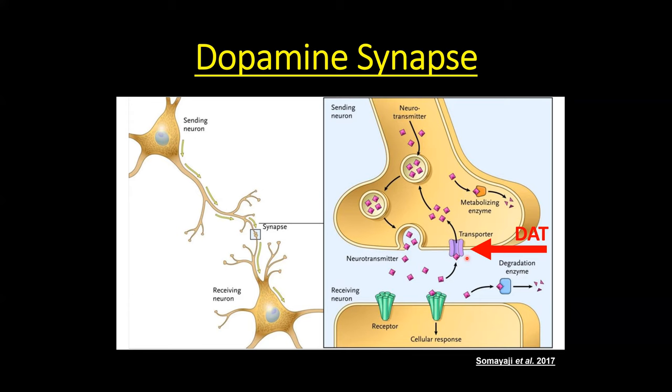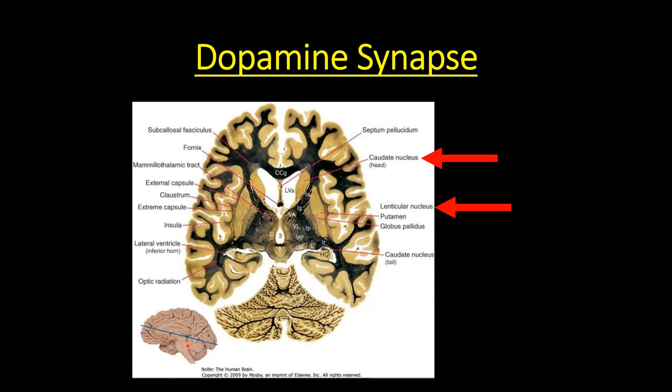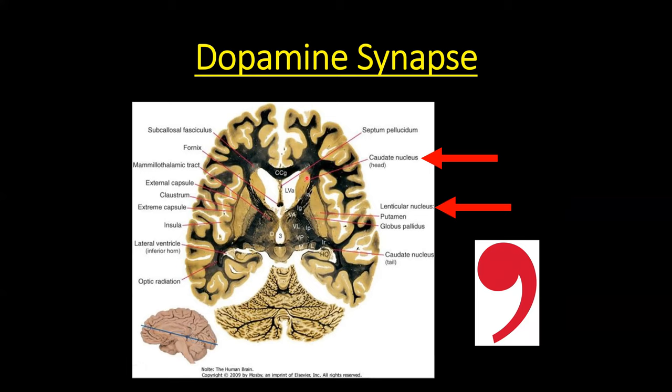And where we're really looking in the brain, so here's the brain. If we take a cross section through it, an axial section, this is the front of the brain and this is the back of the brain and cerebellum. We're really looking at the caudate and the putamen, which together are termed the striatum. This is one of the main dopaminergic centers of the brain, where a lot of these dopaminergic signals are sent from the brainstem. You can envision that this almost looks like a comma. The caudate head is the top of the comma, and the putamen is the tail going down. So when we're looking at these studies, we're looking for the striatum to look like a comma.